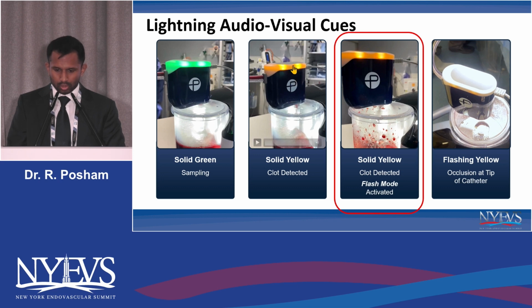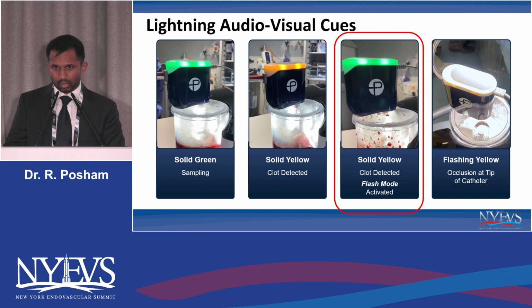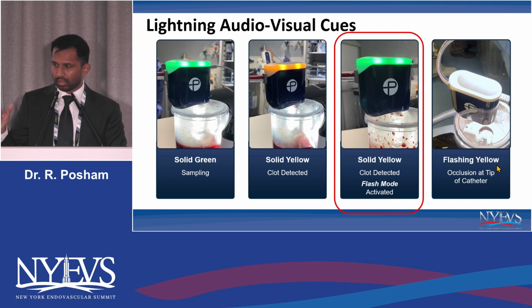turns orange. And when the flash mode is activated, which comes with the flash catheter, the Lightning Flash device is black, and the other catheters are white. This mode is rapidly switching on and off, and it's meant to suck out as much clot as possible. And then you have it turn yellow, and there's no aspiration being performed because it detects that there's an occlusion at the tip.